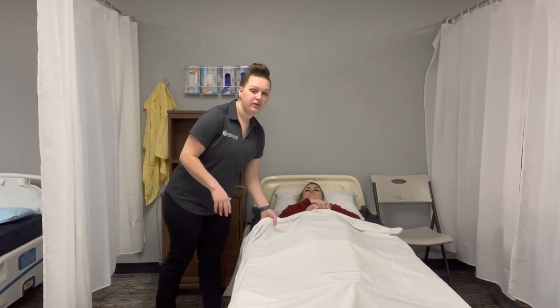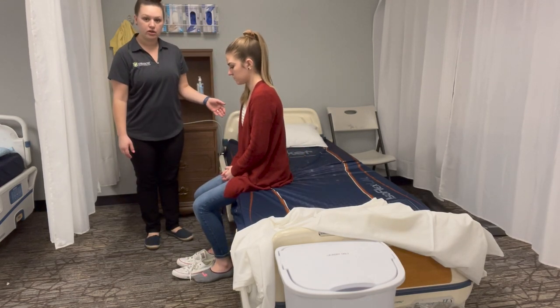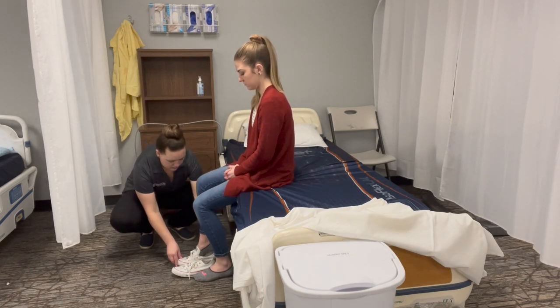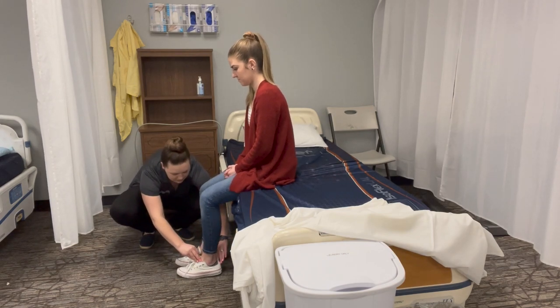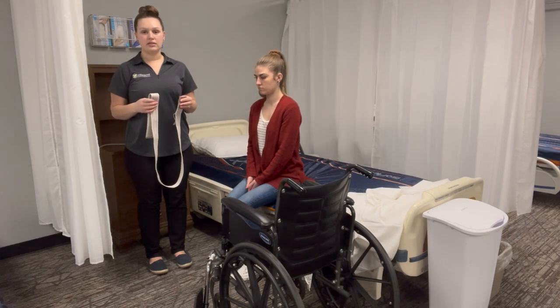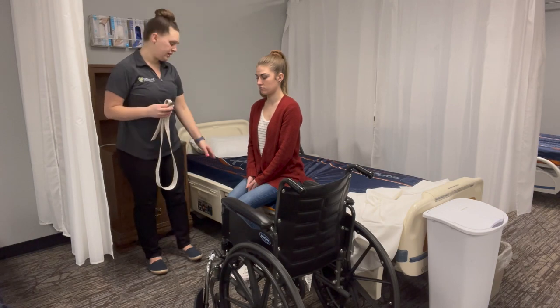We're going to sit her up on the edge of the bed. We're going to make sure that her feet are flat on the floor and we're going to help her put her non-skid shoes on. Now that Allison has her non-skid shoes on, we're going to place the gait belt on her. We're also going to make sure that the bed is in a safe position and locked.